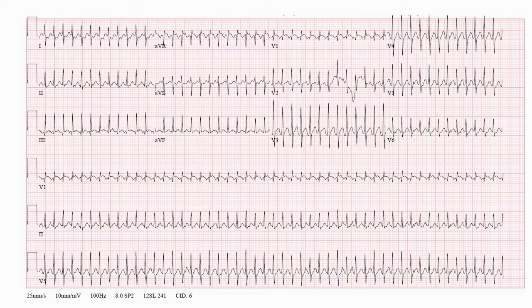Yeah, it's a good question and an important question because, as you mentioned, a lot of times in kids and sometimes in neonates even, there just isn't enough room to place the stickers in the proper location if we're using adult stickers. Especially if we're going to 15 different stickers on there. Right. So the answer is that it doesn't change anything if you cut the stickers, as long as there's still good contact between whatever is picking up the electrical activity and the skin. All right, thank you. That's very helpful.